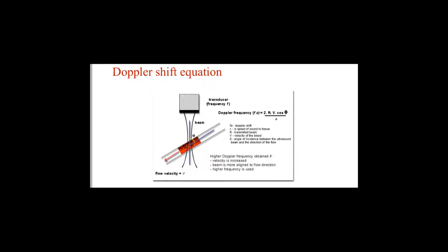And that's why if you compare the pediatric probe with the adult probe, you'll find that the pediatric probe has higher frequency than the adult probe. And why is that? Because they are not concerned like us in adult echocardiography with the penetration, because they are dealing with small chested children. Okay, so they are going to get the higher frequency and, as a result, higher image quality, and the penetration, though it's low, is sufficient for children.